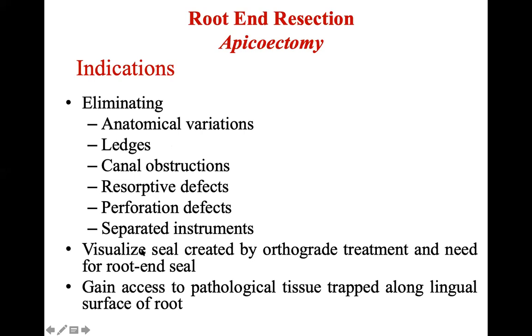When all these things are not there but you are still doing an apicectomy, then you may want to visualize the seal created by the orthograde treatment when you want to do a root end sealing. Or if you want to gain access to pathological tissue trapped along the lingual side of the tooth.